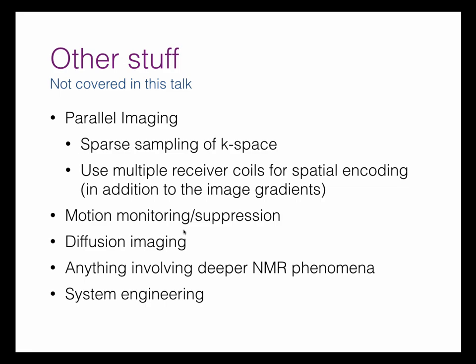Vinay? Or those like radial scans. Yeah. There's a bunch of techniques where you acquire gradient echoes not on a Cartesian pattern, but oriented through the center of K-space, so they form a star pattern instead of a grid. The effects of motion tend to show up in the phase of the signal you collect.